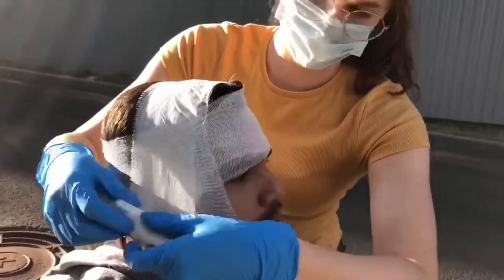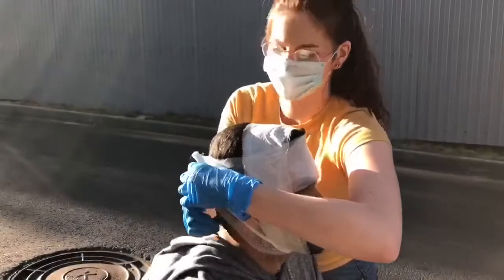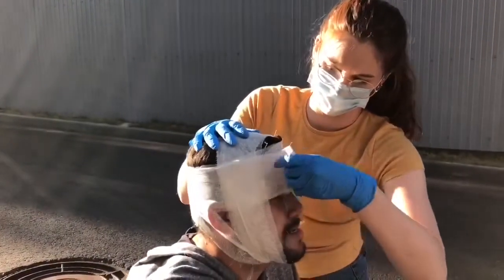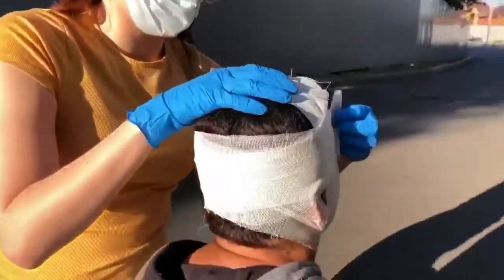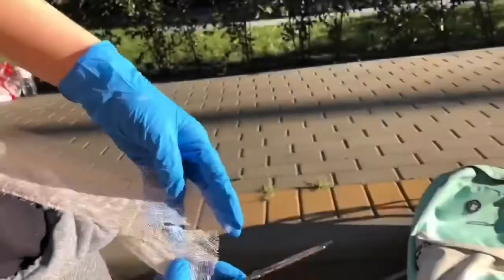After, it will pass on the top of the head and under the lower jaw once more. Go obliquely upwards in the direction of the back of the head and make circular movements passing on the forehead and in the occipital region to strengthen and secure the bandage.